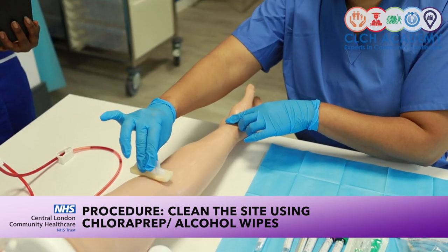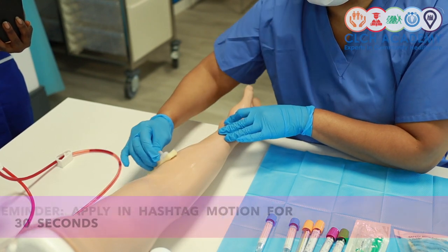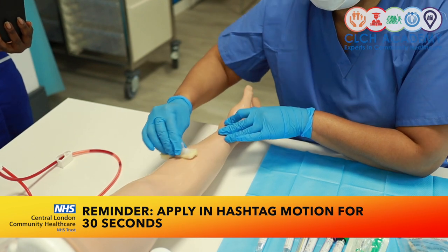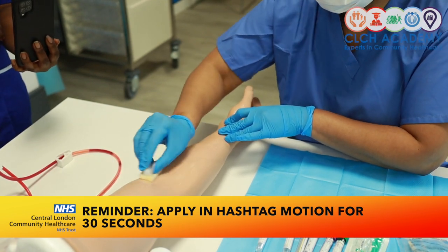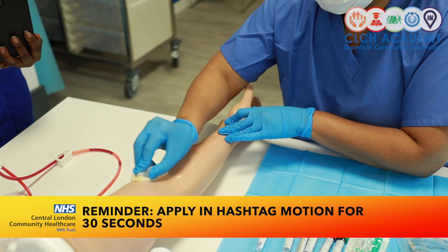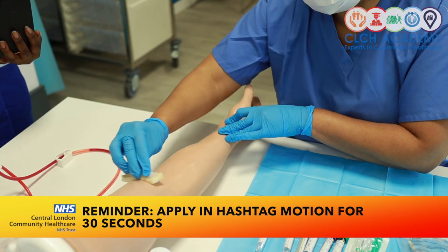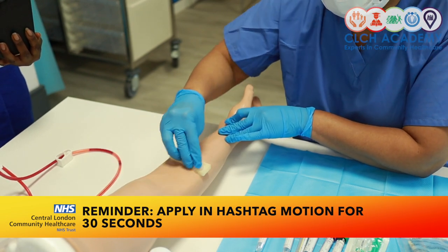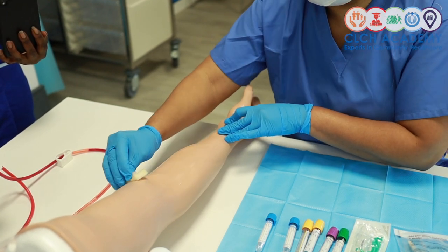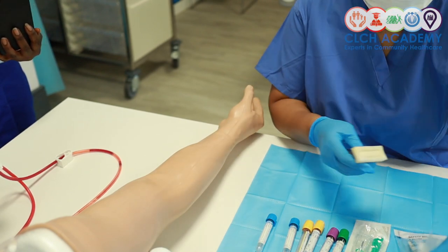One snap, a gentle dab to activate the liquid. And I'm doing a cross-hatch or hashtag action in terms of cleaning. So it's up and down and then across. Up and down and then across for approximately 30 seconds. This is so that you get the ChloraPrep to penetrate that initial layer of skin and actually begin to deal with any bacteria that lies on the skin surface. Then leave to dry for 20 to 30 seconds.